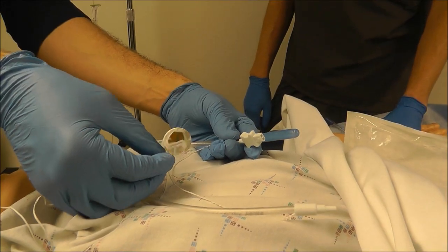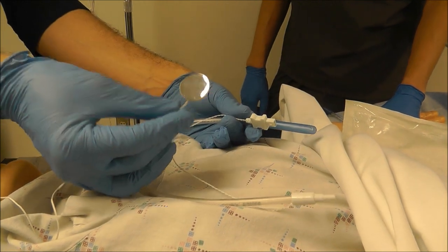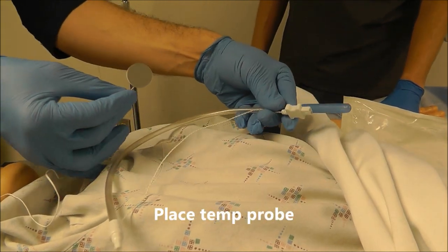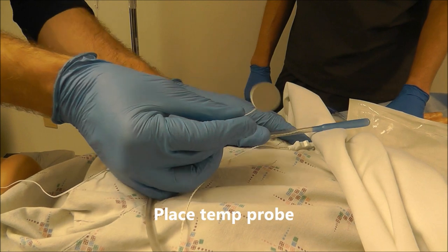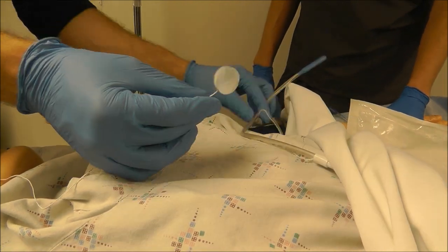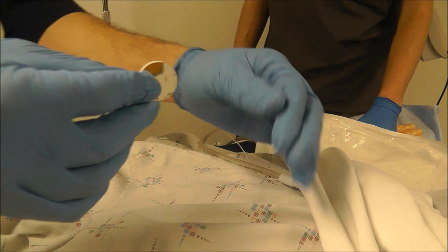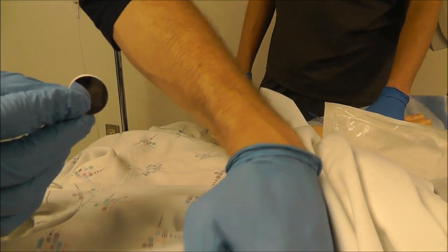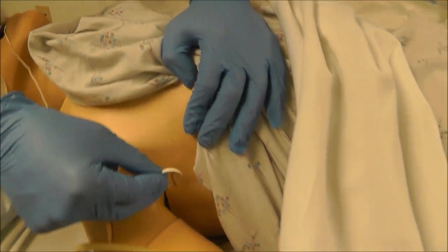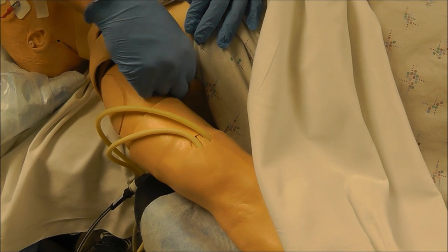Once you get the nerve stimulator on, we're going to want to put in a temperature probe. We can use an esophageal temperature probe, or we can use a skin temperature probe. This particular temperature probe is designed to go in the axillary region.